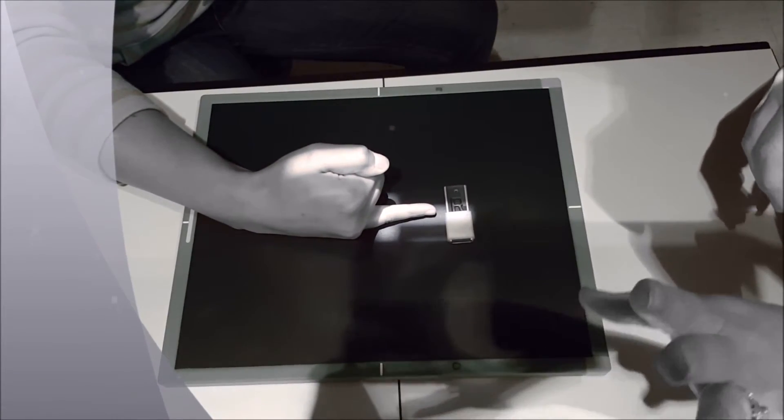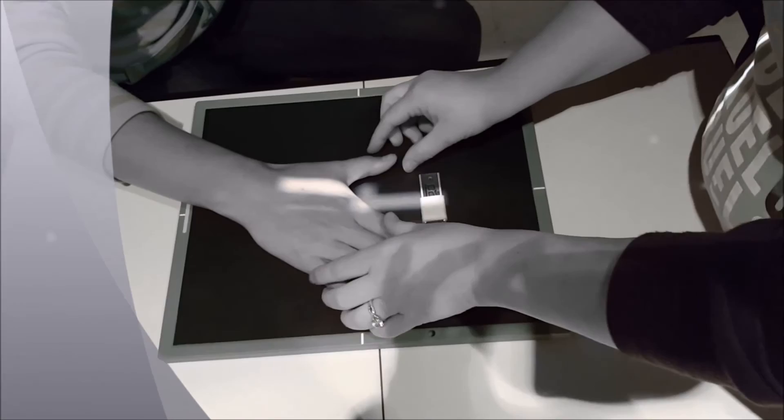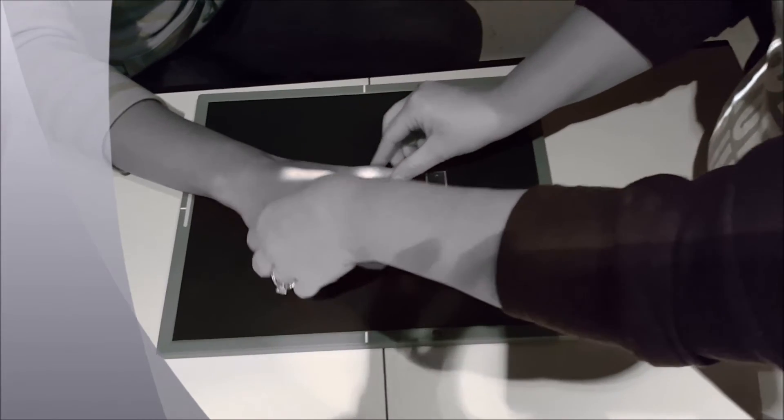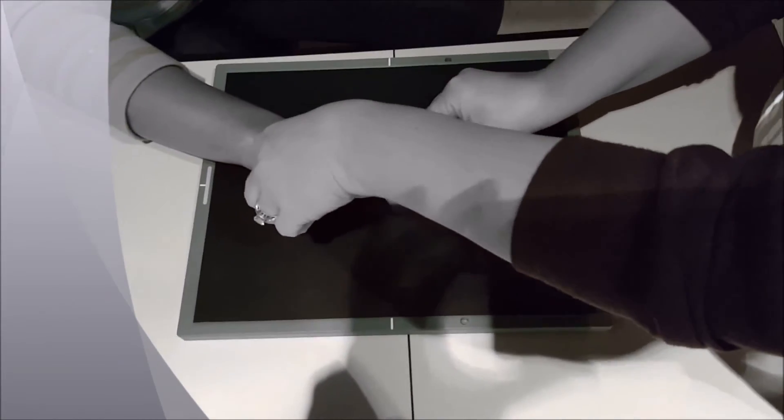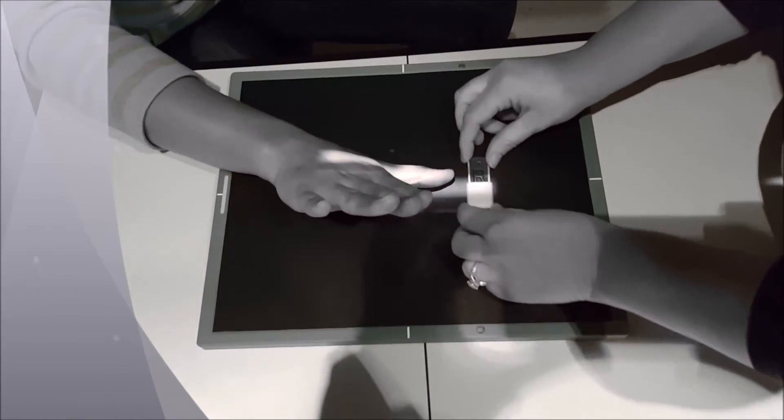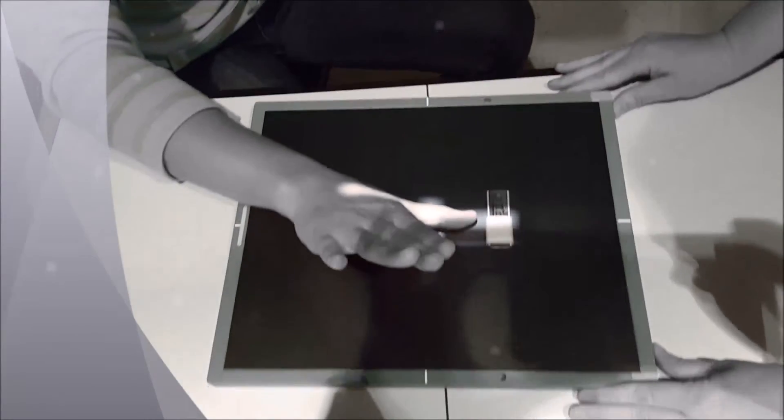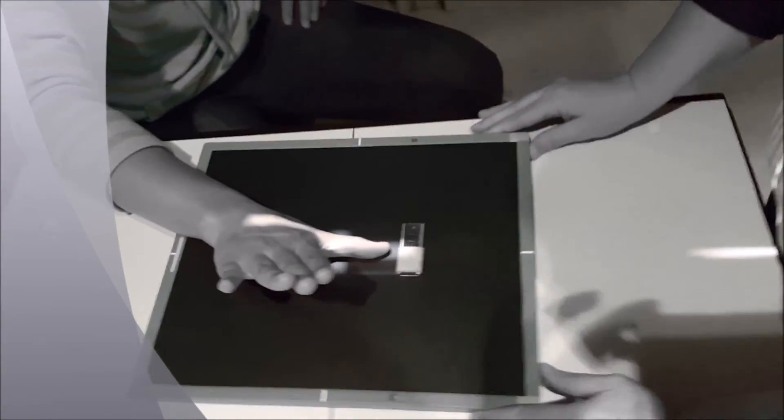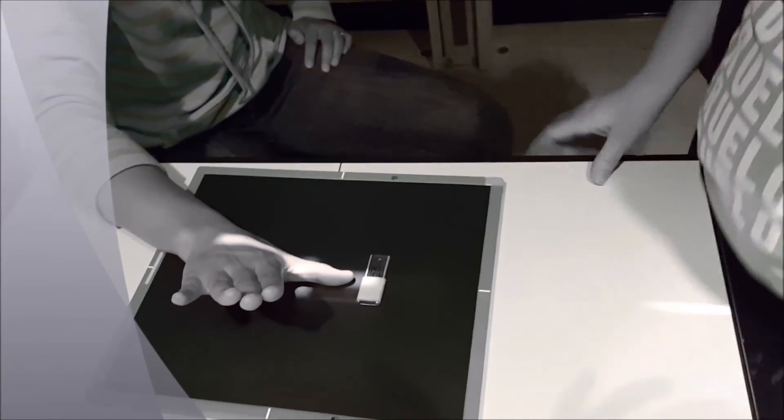For the thumb, if you go from this position here, you're just going to turn their hand up so the thumb is on its side. You're going to center to the interphalangeal joint of the thumb.